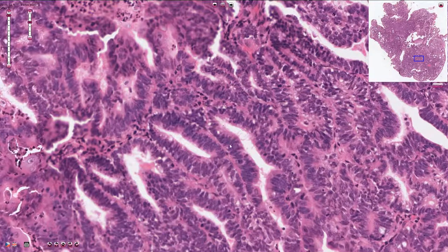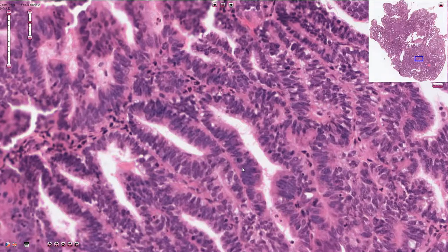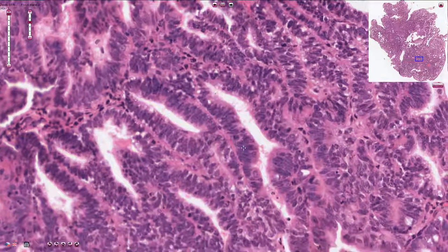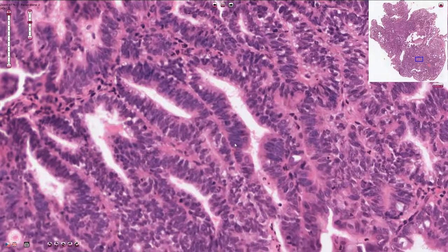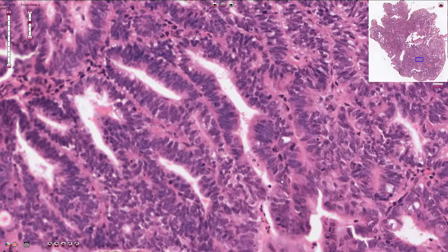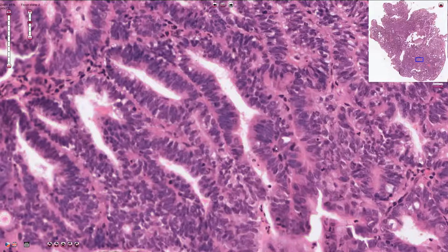The epithelium is pseudostratified and slightly resembles proliferative type of endometrial epithelium. However, it is associated with cytomorphological atypia — we see much more mitotic figures, we see an irregular chromatin pattern, some hyperchromasia of the nuclei, and sometimes we can find prominent nucleoli.